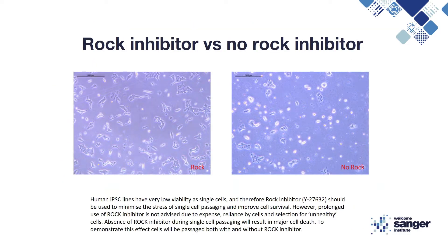Rock inhibitor is extremely important for single cell passaging of iPSCs as they have very low viability as single cells. However, it should not be used for prolonged periods as the cells may become reliant on it, which can lead to the selection for unhealthy iPSCs. Absence of rock inhibitor can result in high levels of cell death. This will be demonstrated by passaging both with and without rock inhibitor.